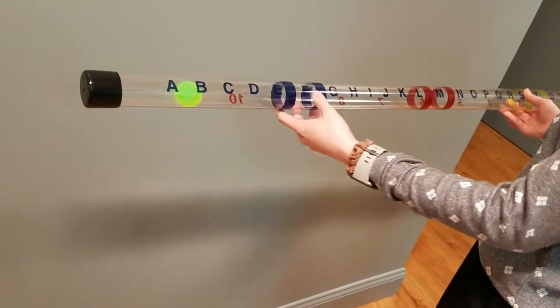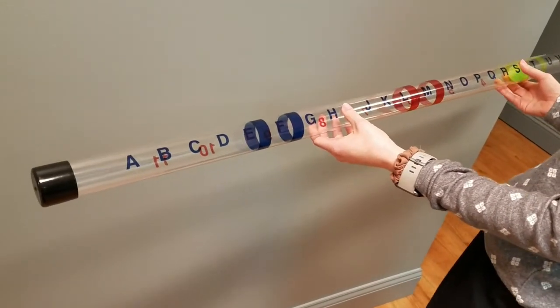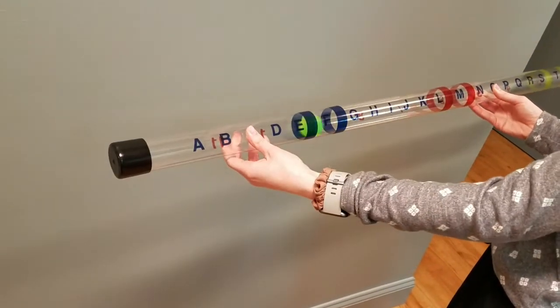You may use this in combination with your zip code charts, your letter charts, or your number charts so that the client can work on looking from near to far, simulating board to table, and working on cognition at the same time.